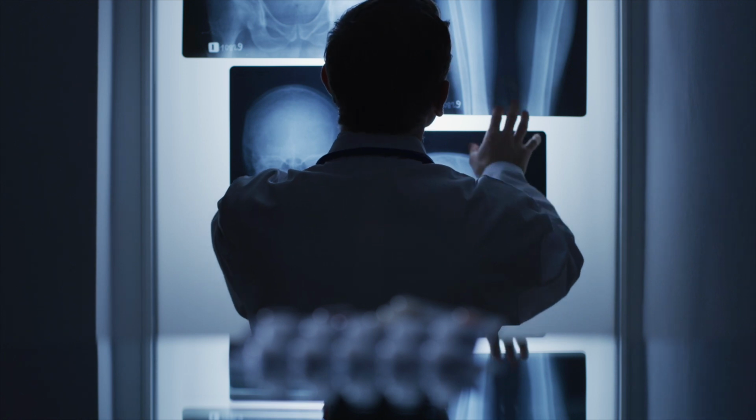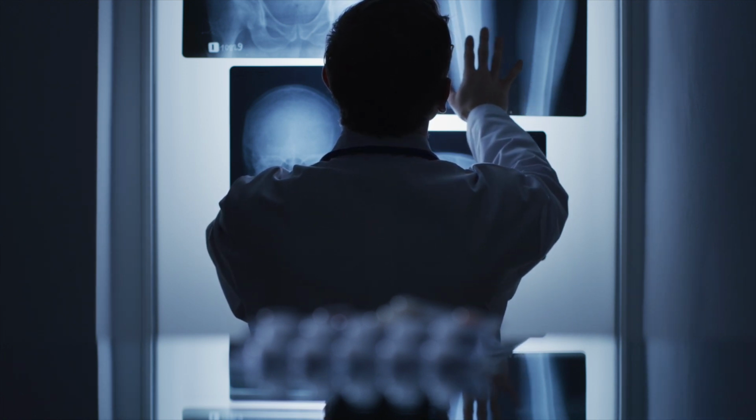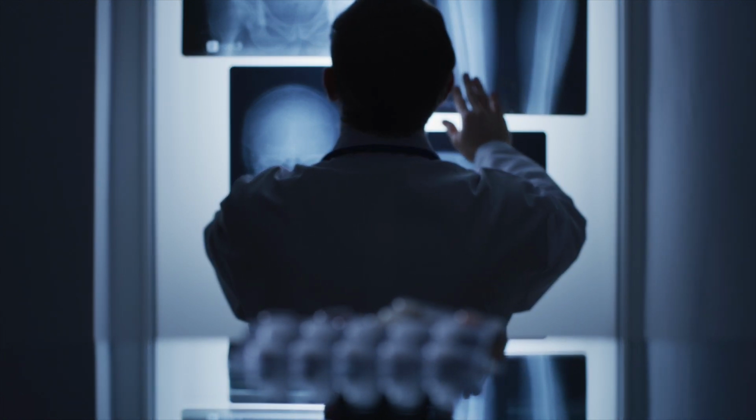Now, the X-ray can serve for a lot of different things, right? Again, it looks for breaks, broken bones, what have you. It looks at alignment, right? And so if something's out of alignment, right, you'll have some people who, for instance, dislocate their kneecap. The kneecap will pop out of place, right? The X-ray will tell me, hey, that kneecap is kind of sitting to the side or sitting straight in the middle where it's supposed to be, right?